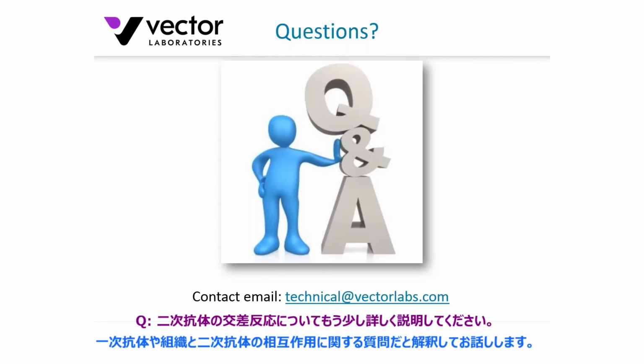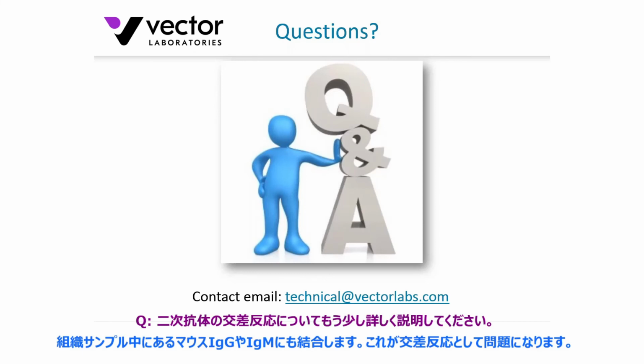Okay, so, well, I'll interpret that as being a secondary antibody interaction with the primary or the tissue type. So, for example, let's just use the example I used a little bit earlier on, say a mouse primary antibody being applied to a mouse specimen. I hope I'm interpreting this question appropriately, whereby you're using an anti-mouse secondary antibody to recognize that unconjugated mouse primary antibody. That secondary antibody, of course, would bind to not just the mouse immunoglobulin, whether it be a mouse IgG or IgM, but also inherent IgG or IgM in that tissue preparation.